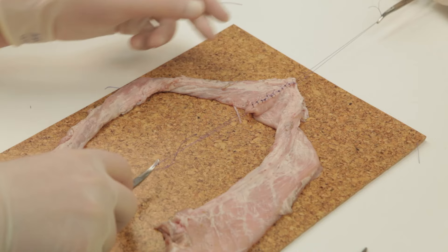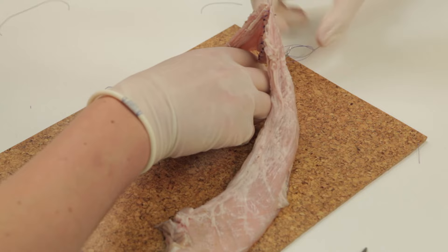Further sutures can now be applied in a similar manner to close this side. Once this is finished, pass the clip back under so the bowel is now facing its original position.